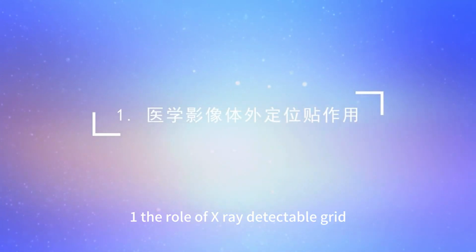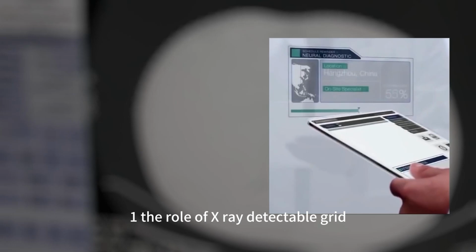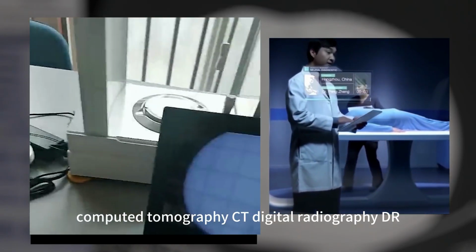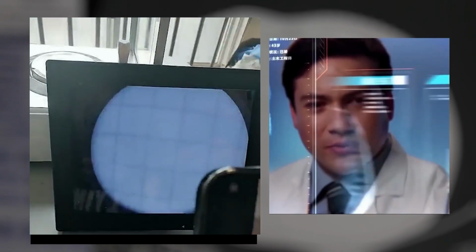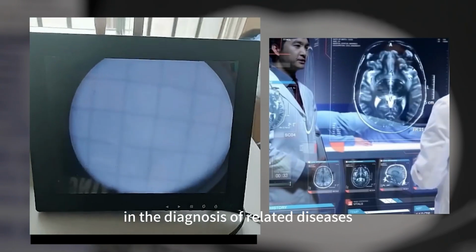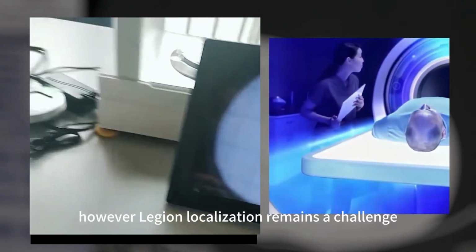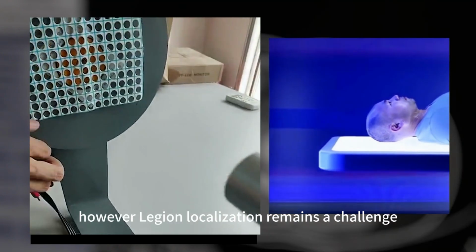1. The role of the X-ray detectable grid. Computed tomography (CT) and digital radiography (DR) have been increasingly used in the diagnosis of related diseases. However, lesion localization remains a challenge.